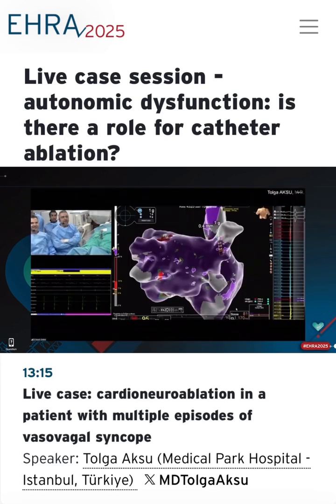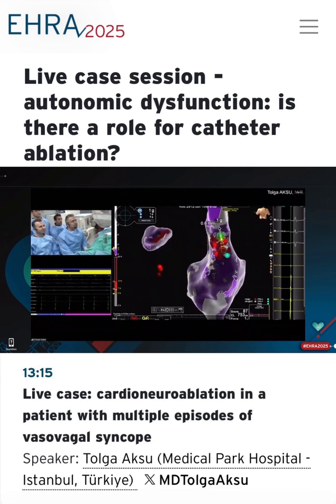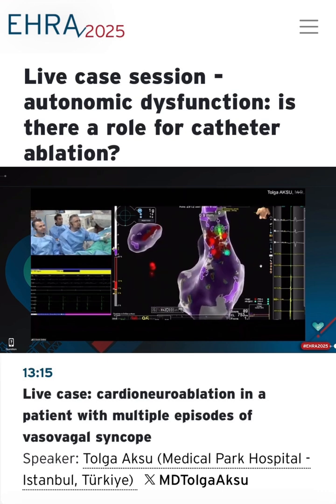Hi everyone again. We now mapped and ablated the left atrial and right atrial parts of the right superior GP. Please remove the left atrial map to see our ablation for the right superior GP via the superior vena cava. Yes. Look at that. There is no EGM. And please add epicardial GP on the CT specimen as well.